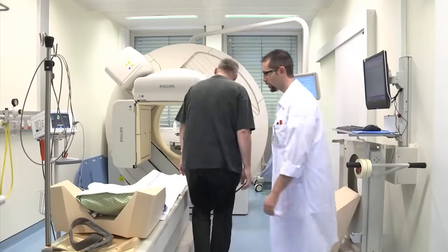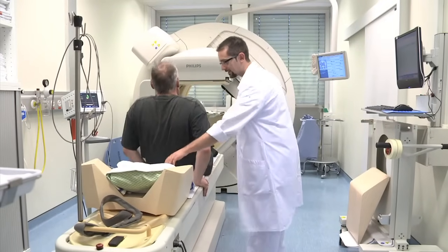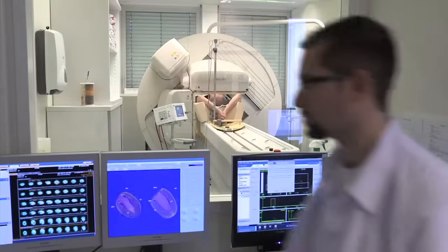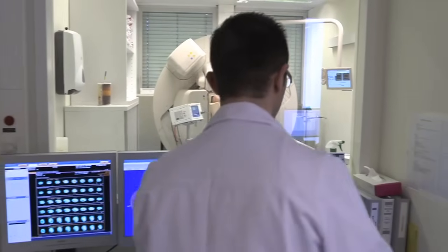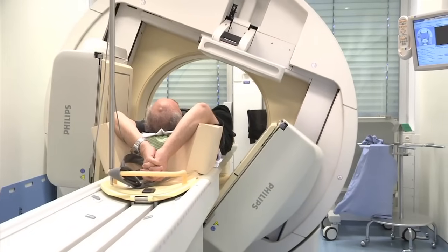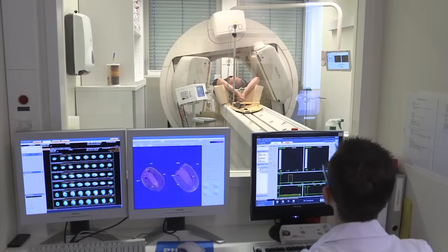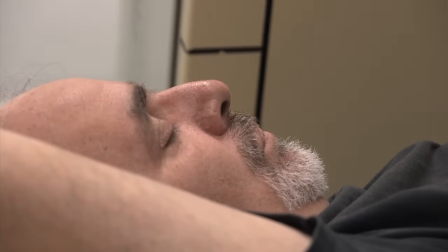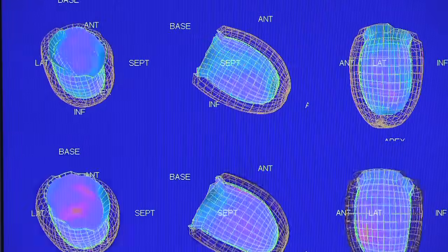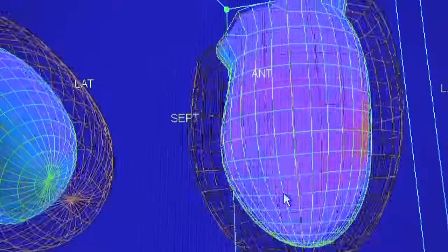Ça va durer à peu près 20 minutes. Je vous laisse vous allonger sur le dos. L'examen est réalisé en position couchée sur le lit de la gamma-caméra. Il est important de rester immobile pendant que le détecteur se déplace en tournant autour de vous pendant environ 20 à 30 minutes. Une gamma-caméra détecte le rayonnement émis par le produit injecté, ce qui permet de prendre une image de votre cœur.